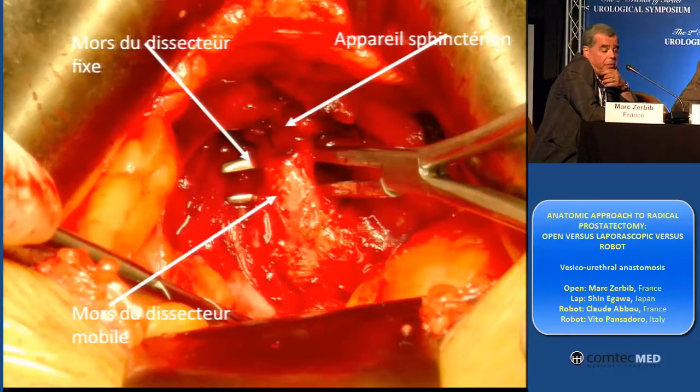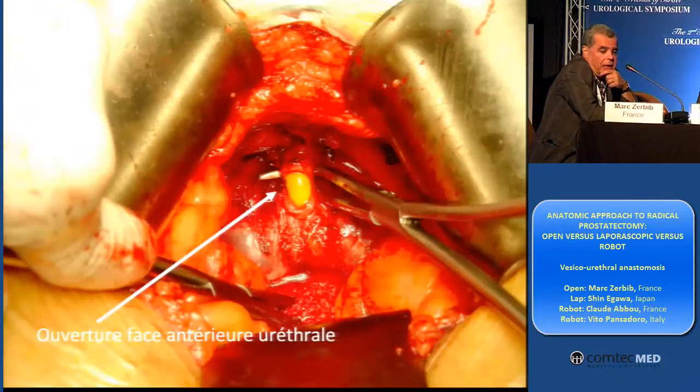It's the first step of my procedure, not the last as with laparoscopic or robot. As you can see, you see the urethra, and I can open it on the catheter. And I use for the anastomosis — I put my stitches immediately.